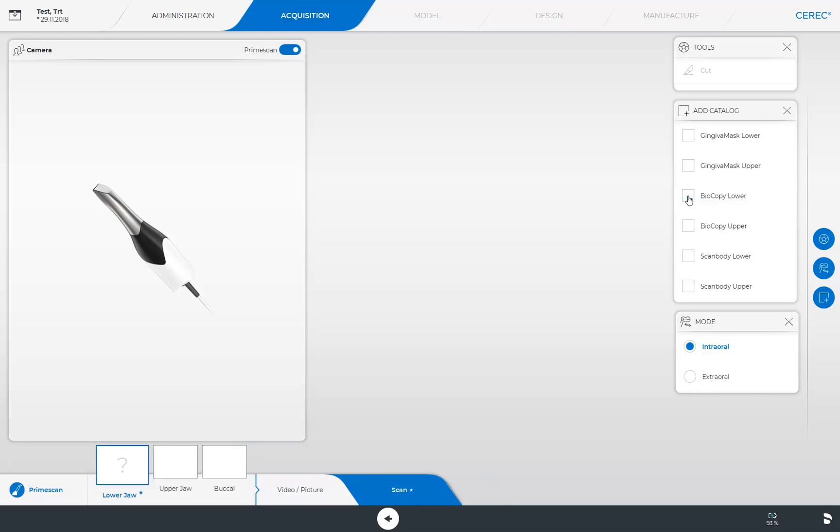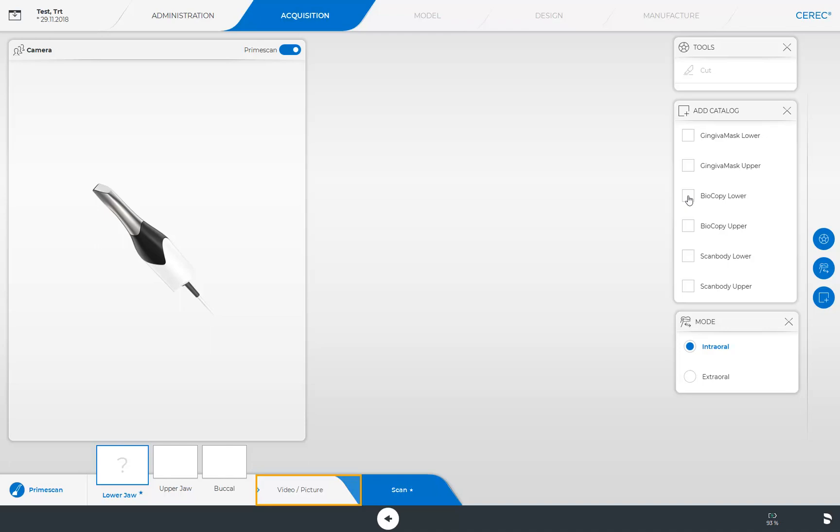Next, we look at our step menu and the associated functions. During the scan phase, we can switch between the video picture and the scan steps. Currently, we are in the scan step, as indicated by the blue marking of the step. For demonstration purposes, we select the video picture option.